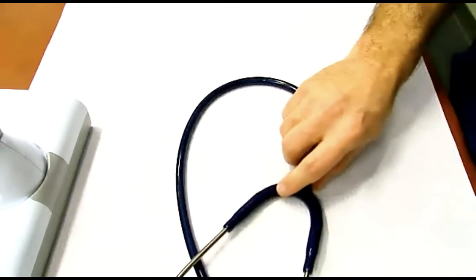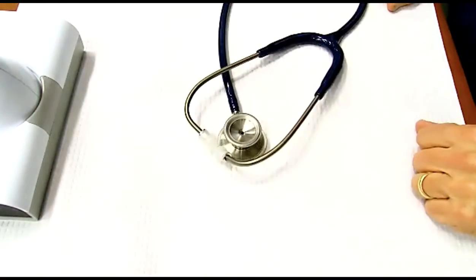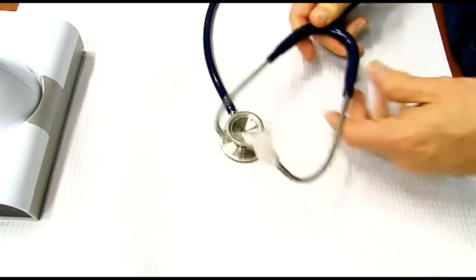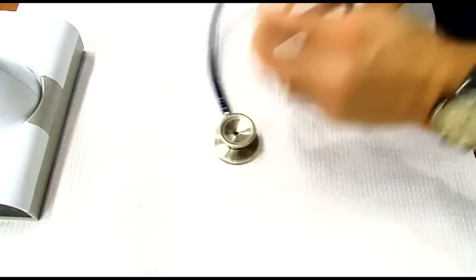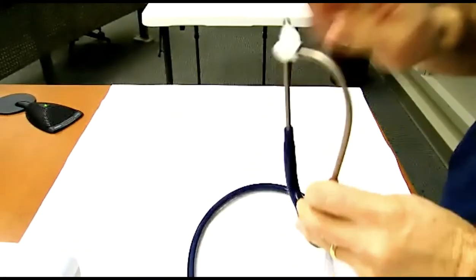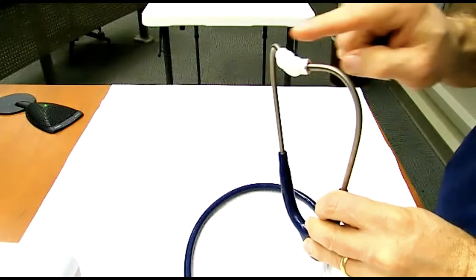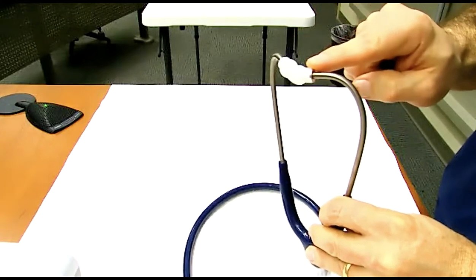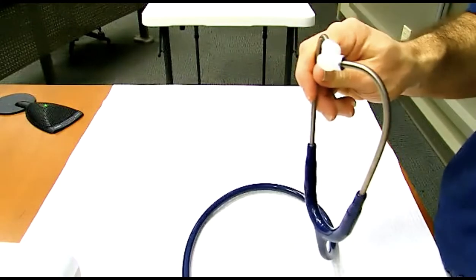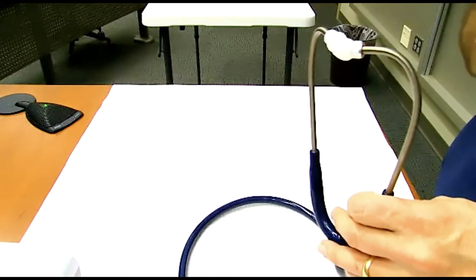Grab your stethoscope. Here's some pieces and parts we want to talk about with that. All right, I need to remember to orient myself. All right, got your stethoscope? Let's talk about some pieces here. First of all, let's start at the end here. Hold this a little bit higher. Talk about the tips. So you're going to put your ear tips. This probably came with ear tips already attached, these silicone ear pieces. Now, I think there was another size, a smaller size that came in the box. Don't lose those.